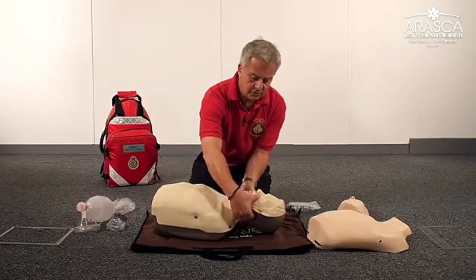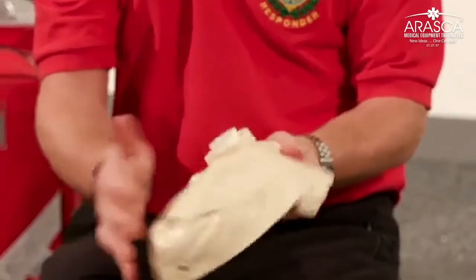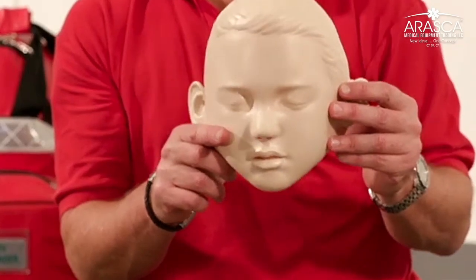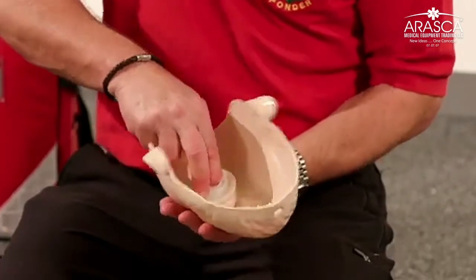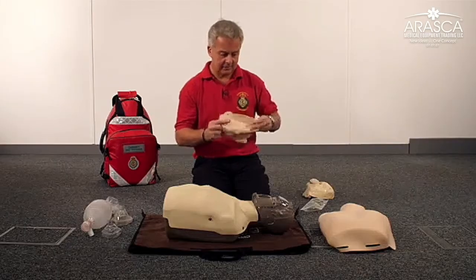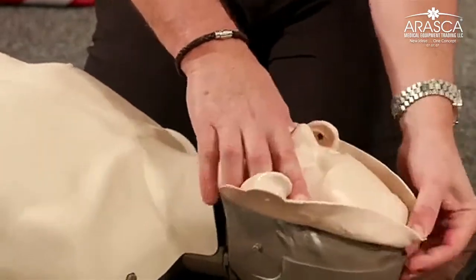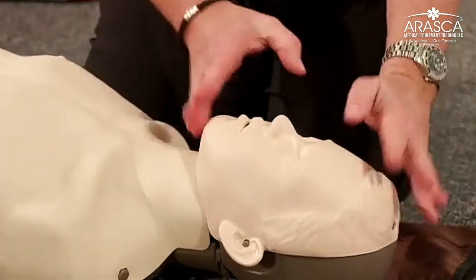First, take the face skin off the mannequin as you would in the normal way when cleaning the mannequin. Then take the replacement face skin from your kit, which is representative of the 10 to 12 year old boy. Connect the O-ring connector as you would normally with the adult so that it's in place and correctly located, then apply the face skin — exactly the same as with the adult. This face skin is now representative of the 12 year old boy.